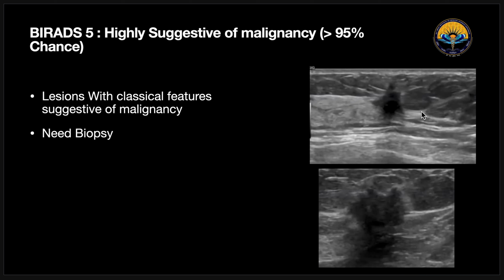Then coming to BIRADS 5, here there is more than 95% chance that this lesion will be malignant on biopsy. It has all the classical descriptors of malignancy, so this lesion definitely needs biopsy. Then BIRADS 6 is a biopsy-proven malignancy.